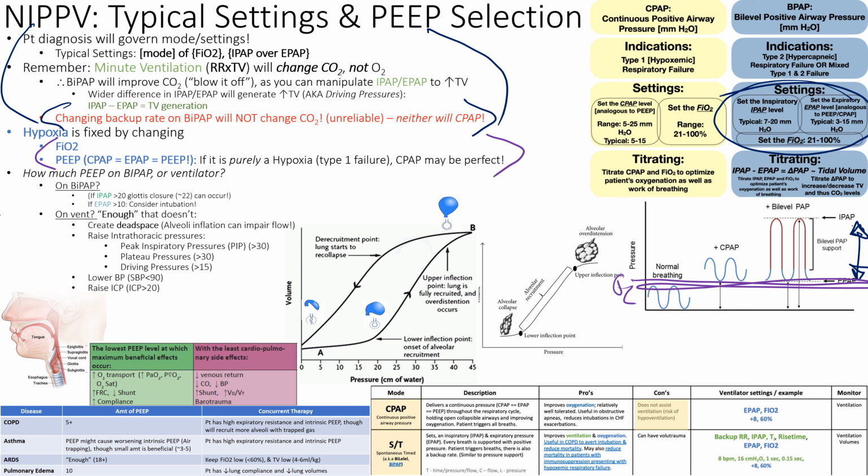We're not letting anything less than that inside the lungs. So we're keeping our lungs open at all times. We don't want our lungs to go all the way down to a deflated state, right? If you ever blew up balloons for your 3-year-old niece's party, and you had to blow them all the way up from scratch.